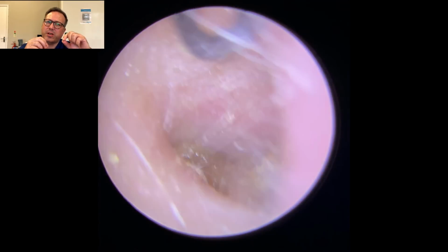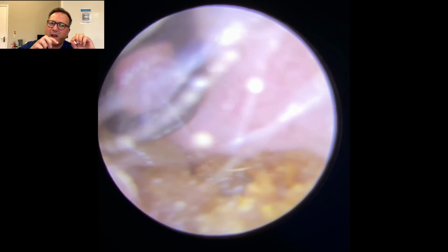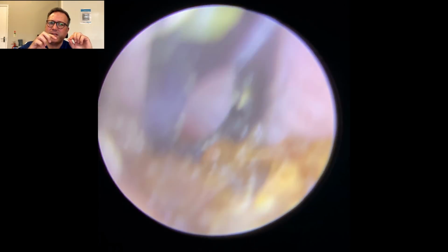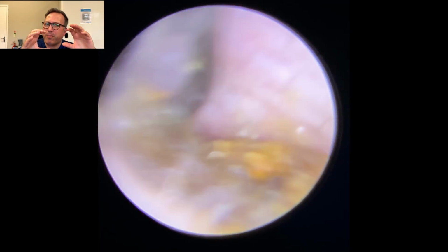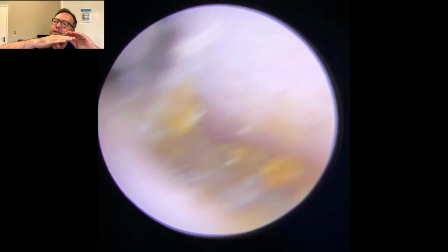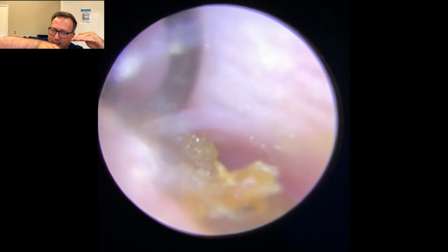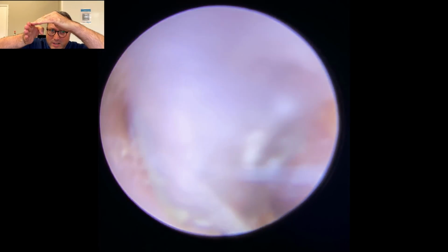Now, I've slowed this part down because what I want you to see is what happens if you haven't got the clearance then for the Jobson horn. When you've got this type of wax here and you try and push through, what you end up doing is pushing, see how it pushes the wax further in? It doesn't allow you to get the kind of slanted end of the Jobson horn over. As it just hits the front, it just tips this wax back all the time.